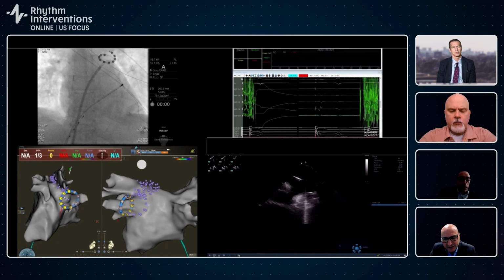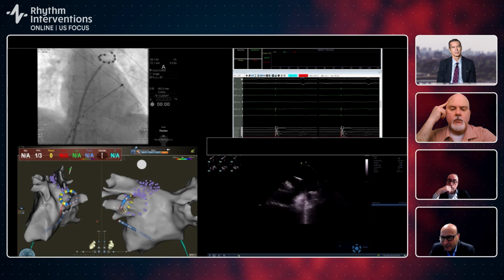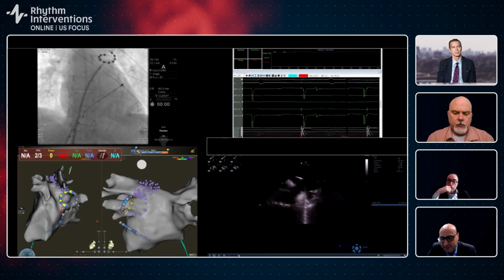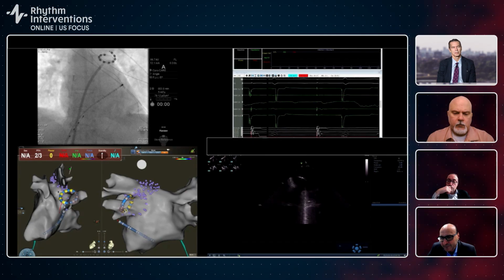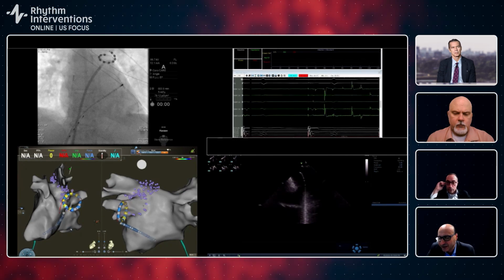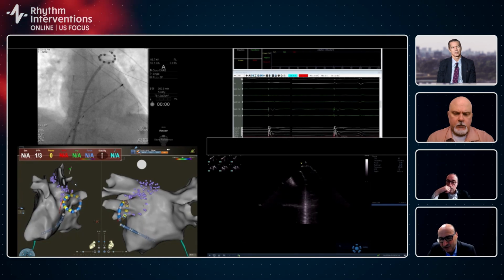I just want to stop for a second, Rodney, here, and show this feature of the catheter where you can activate only half of the electrodes. So you see the catheter is not going in full, like around totally, it's a little bit wedged. So the posterior part of the catheter is deeper in the vein than the anterior part. And this is one example where you may not want to ablate from all the 10 electrodes. So you can choose only the anterior electrodes to ablate from, which are more proximal, and don't ablate from the posterior electrodes.